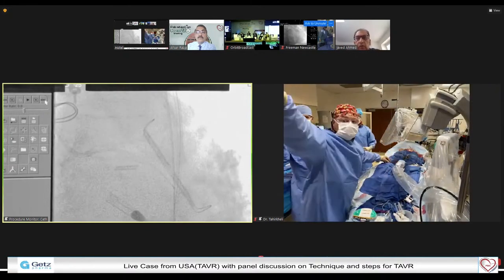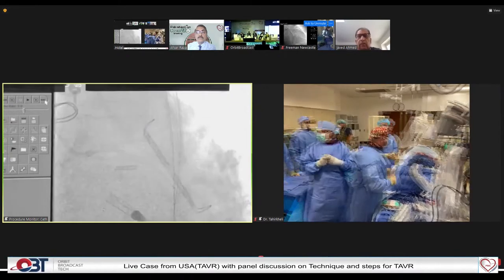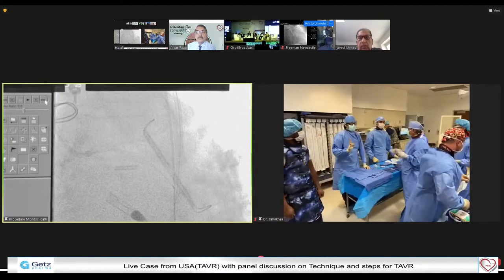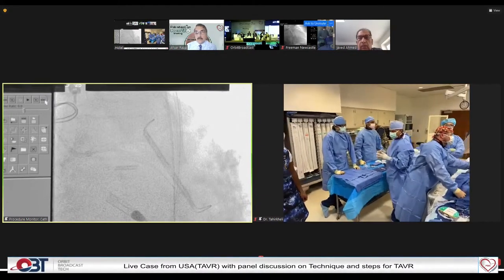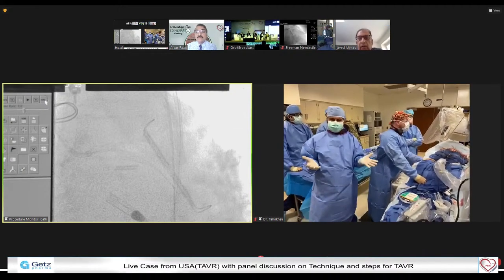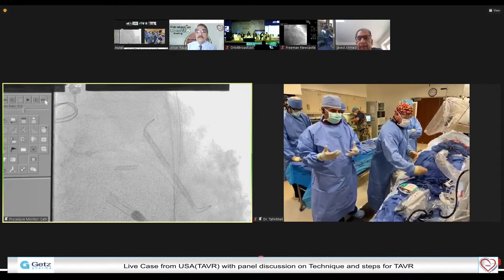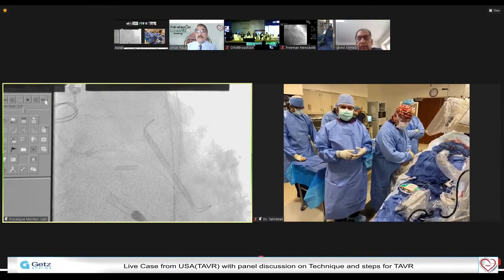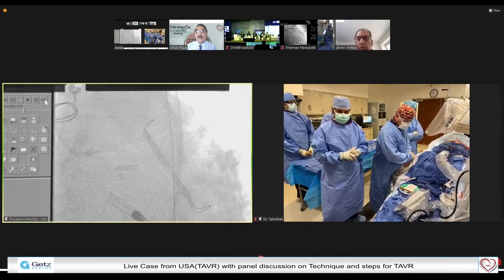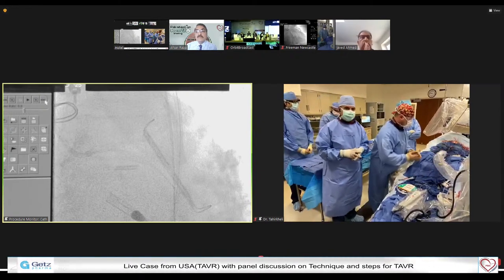While they're doing this, I will just circle around the cath lab. This is Brad here, Dr. Naveed Ahmed, Eddie, Tina, Dr. Saeed here, Dr. Heather Ali here, Tim Kostelecki, our nurse. We've got Dr. Shet back there, who's anesthesia. This is an Impella case, and these sometimes are 3-4 hour long cases. So we've gone to having conscious sedation done by anesthesia. In the past, patients would move around and sometimes come off the table, hurt and all that. So this is a lot more controlled situation. And obviously today I was not going to have him move around too much. So Dr. Shet is here helping us out with that.